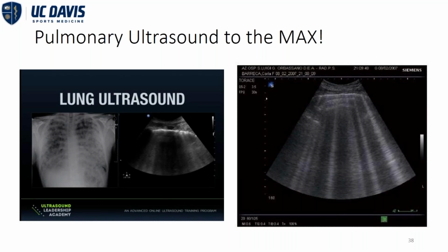So this could be either a cardiac contusion, this could be a pneumonia, it could be high altitude pulmonary edema. So it depends on your clinical setting. I remember when I was working up at Snowbird Ski Clinic, there was a ski patroller who said that he always had altitude-induced asthma. So every time he came up in the wintertime, he always had really bad asthma for about 4 or 5 weeks, and then his asthma got better. But when I saw him, it was his worst, quote-unquote, altitude asthma ever. And so I did an ultrasound, and he was in florid high-altitude pulmonary edema.